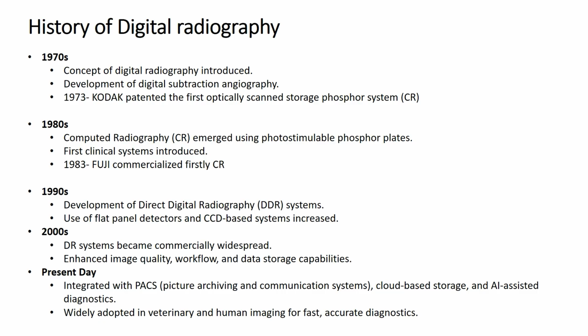The company Kodak in 1973 patented the first optically scanned storage phosphor system. Afterward, in the 1980s, computed radiography emerged. In computed radiography, they used photo stimulable phosphor plates.